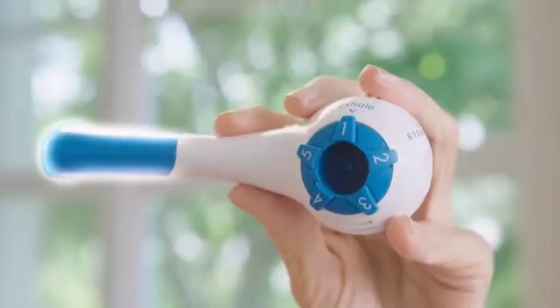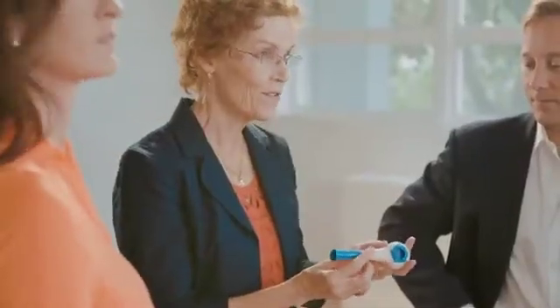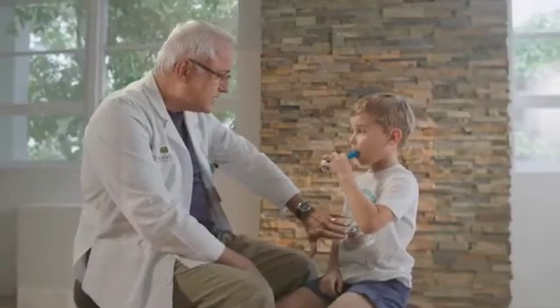If you have not unboxed your Breather yet, go ahead and do that with me now. It should be easy to open. You'll notice the Breather all put together with the standard mouthpiece — it's ready to go. There's also this smaller adapter. This is used in place of the standard mouthpiece in some cases, such as if you're using the Breather in conjunction with another device, or it can be used with a filter that will filter both inspiratory and expiratory airflow to help protect the user as well as others in close contact during use. And in some cases, such as with children, users may find the adapter a better fit to use as a mouthpiece. These circumstances are certainly less common, but we wanted to make sure this adapter was immediately available to any who would need it.